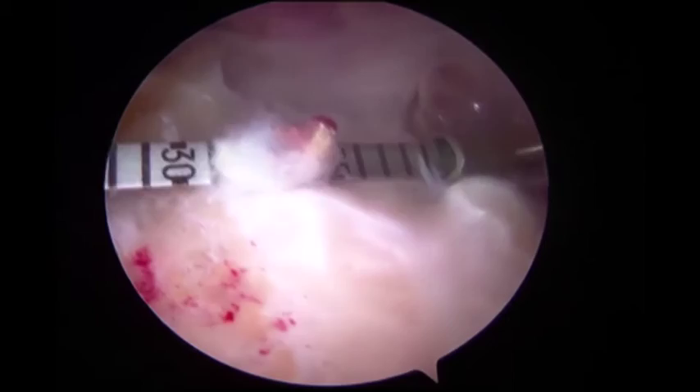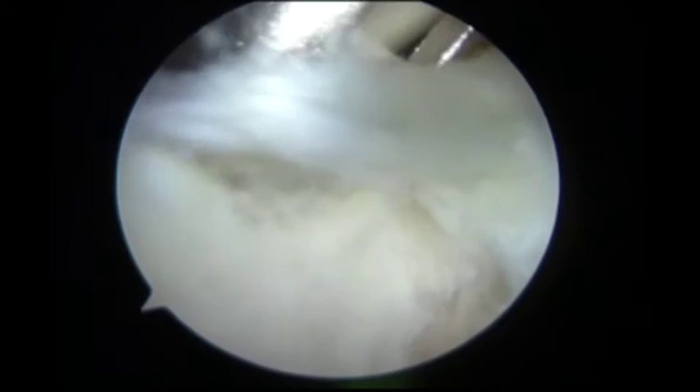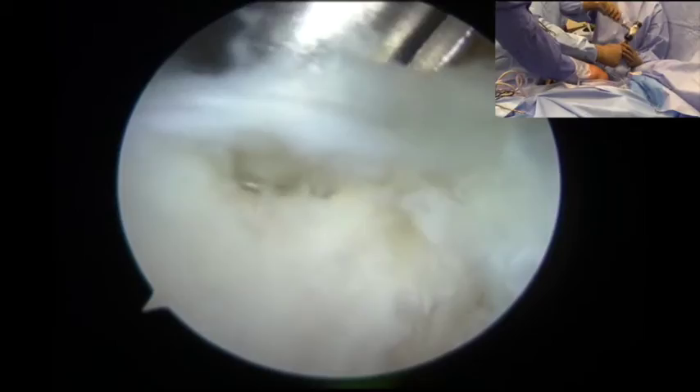The arthroscope was then placed posterosuperiorly, where the distance between the glenoid and the greater tuberosity footprint was measured. The first anchor was then placed along the anterosuperior aspect of the glenoid.